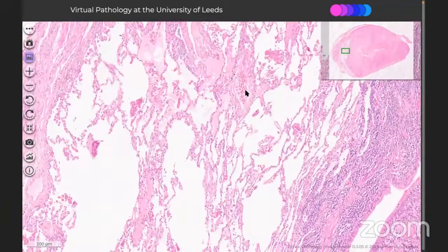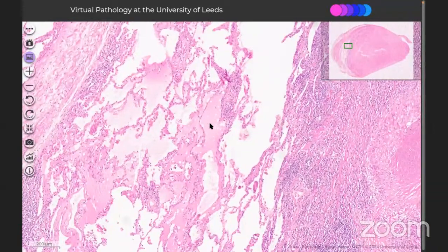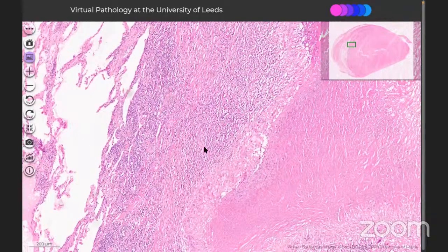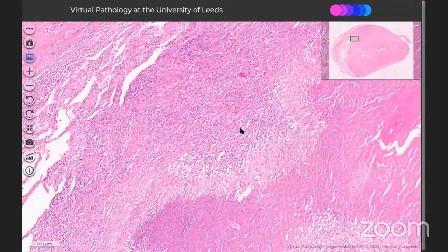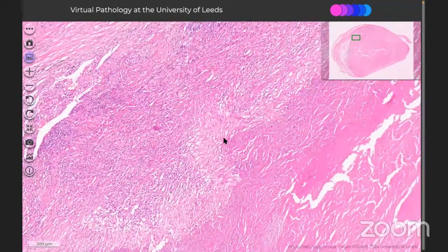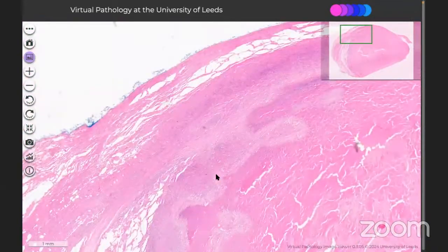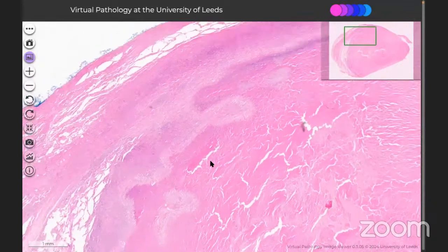This is a granulomatous lesion, granulomatous inflammation. What are the differentials in this case you can think of? You can think of quite a number of differentials. One is obviously tuberculosis, because you see that palisaded granuloma and epithelioid cells, okay, with this kind of necrosis.